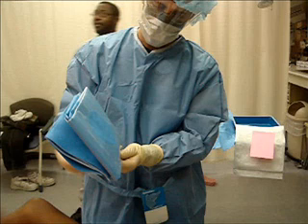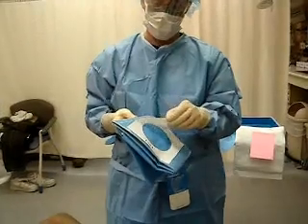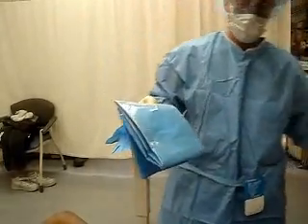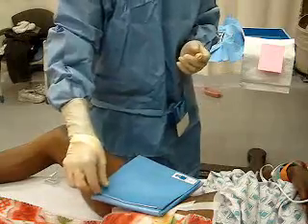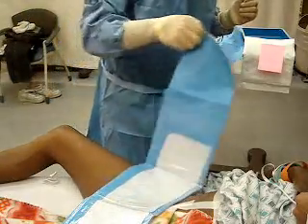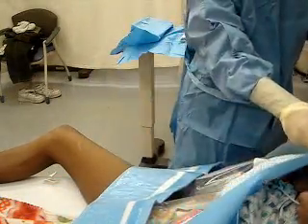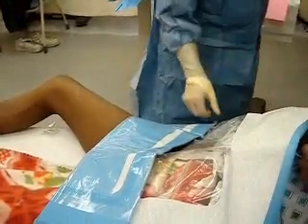It's finally time to get sterile. If you are gowning and gloving, open up your gloves package before you slip the gown on. It's also not a bad idea to have a second set of sterile gloves ready — it's inevitable you're going to touch something unsterile and have to start over. Here we have the preferred type of drape being placed on the patient. It's plastic, very big, and has a sticky piece you peel off and place directly onto the patient's skin so the drape doesn't move during the procedure. It's big enough to put everything you need right on the field — things like your wire or your catheter — so you don't have to turn around and grab from the stand.